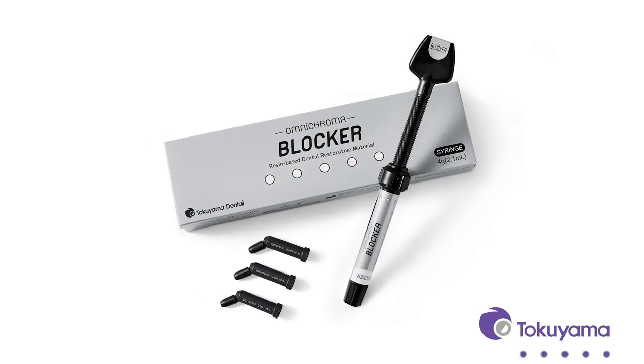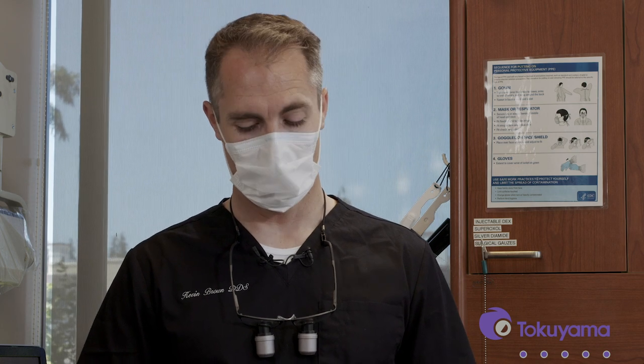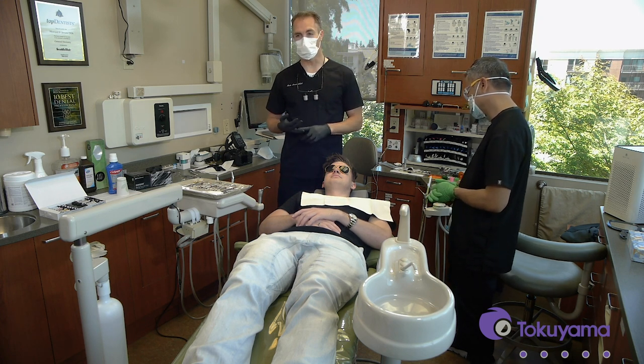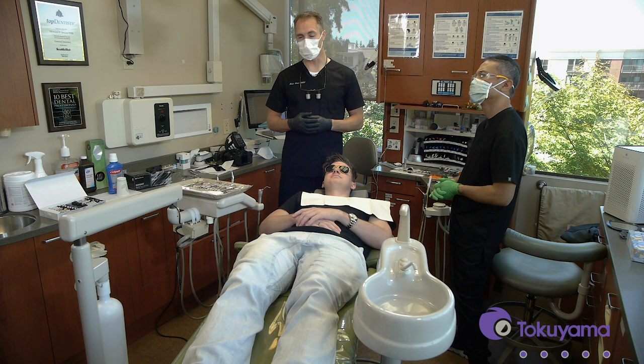As we go throughout this tutorial, we're going to talk about how these materials work, why we need to use the blocker in conjunction with the Omni Chroma in a situation like this, and we'll go through the handling characteristics. For me, the biggest reasons to use this composite in my practice are its ease of use, because it's a one-shade system that will match every single tooth. It simplifies the time in the chair, the products we carry in the office, and helps keep the overhead down.